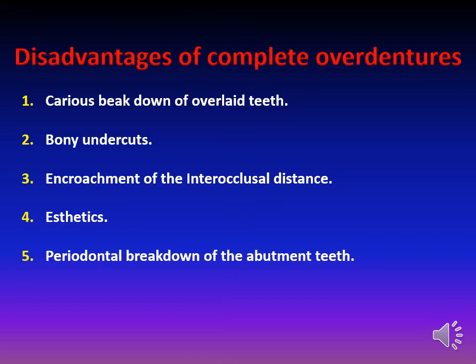Bony undercut, and this is a problem in insertion and removal of the denture. We can make relief and put soft liner to increase the retention.